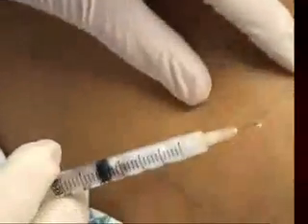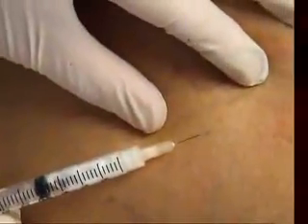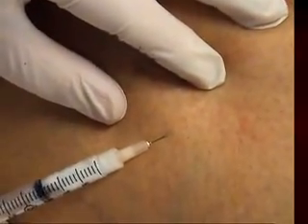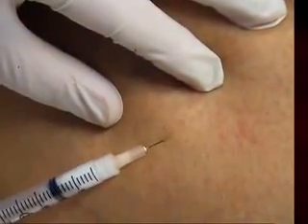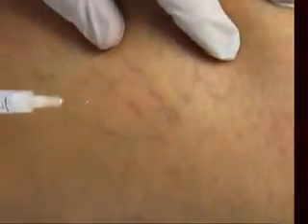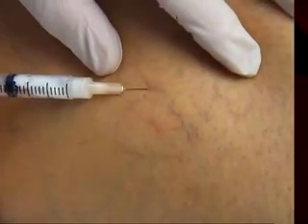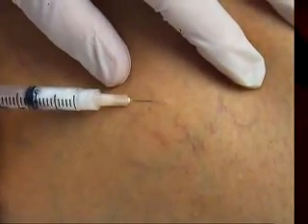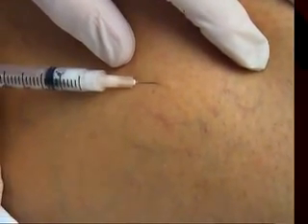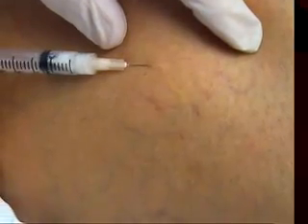And then there's another little vessel here, for instance, I think we should take out. So I go proximal to the vessel and just pop it in, and I can see it just disappear. There you go. And these are smaller vessels, but I'm sure we can get in them. I should never say that, because of course when it happens on film, usually I miss. There we are. I was right and wrong. I missed it, but I got in as well. Bit of both. That was a cheeky one.